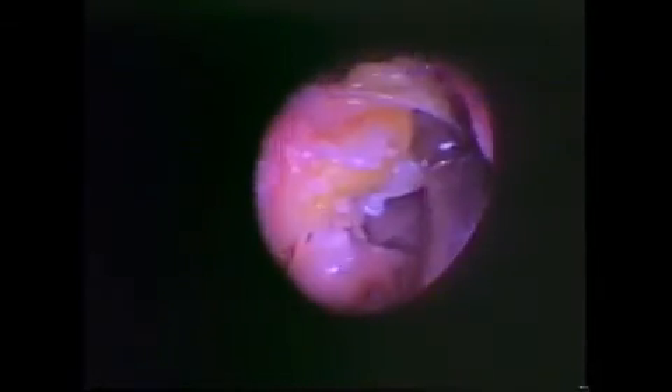The other area of danger is, if you look at the lamina papyracea in the area of the ostium, and you palpate only a little bit too high, you'll be in the orbit as well, and you will protrude orbital fat very easily. But as I told you, this is not a problem as long as you do not mistake this for diseased mucosa. Even an amount like this can carefully be pushed back — put in a Merocel sponge or a resorbable packing, tell your patient not to blow his nose. Maybe he gets some air in his lid or a small bleeding in the canthus, but usually that's not a problem. Of course, if somebody goes on and takes out fat and the medial rectus muscle and so on, this will mean problems.